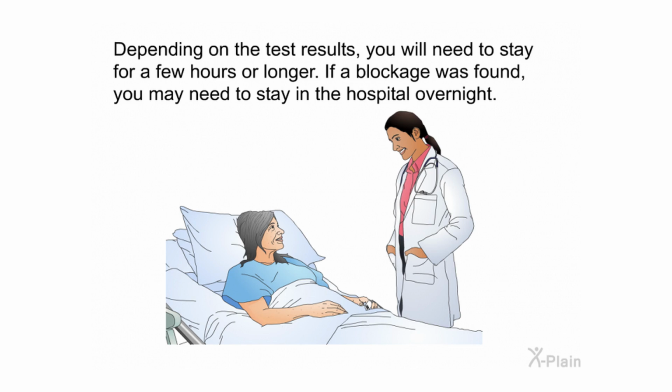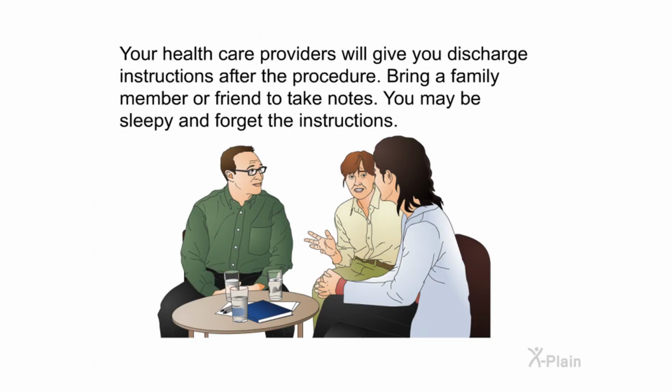Depending on the test results, you will need to stay for a few hours or longer. If a blockage was found, you may need to stay in the hospital overnight. Your healthcare providers will give you discharge instructions after the procedure. Bring a family member or friend to take notes. You may be sleepy and forget the instructions.